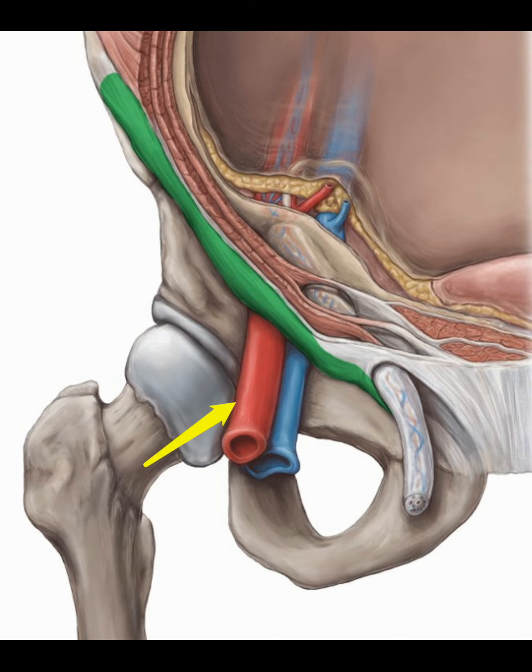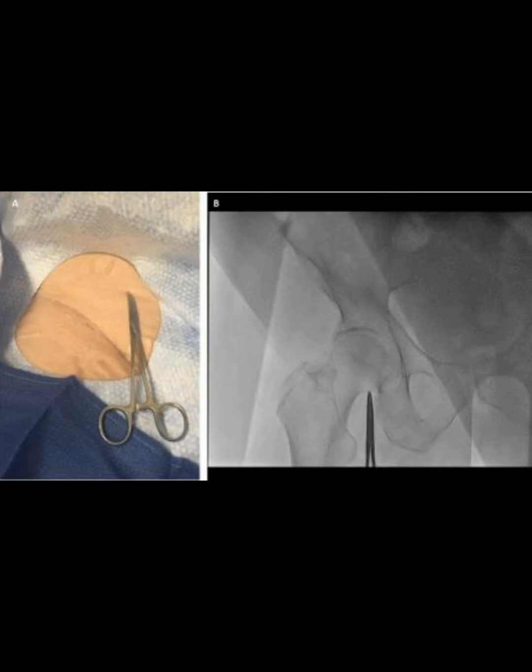Most invasive cardiovascular specialists are trained to identify the mid-femoral head and to stick right below the mid-femoral head. This is usually done by fluoroscopy, by placing the hemostat and performing 1 second of fluoroscopy to identify that, marking that area, and proceeding with entering the skin at a site that takes into account the thickness of the pannus and the anatomy of the patient.